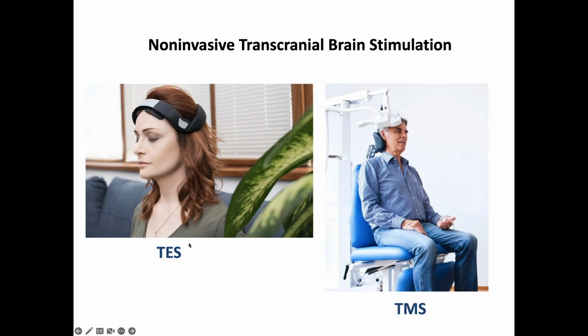And another technique is TES, transcranial electric stimulation, or sometimes also called low output or low intensity transcranial electric stimulation.